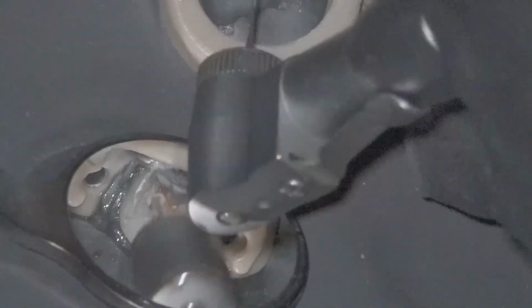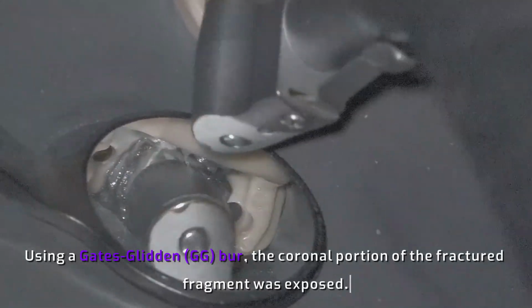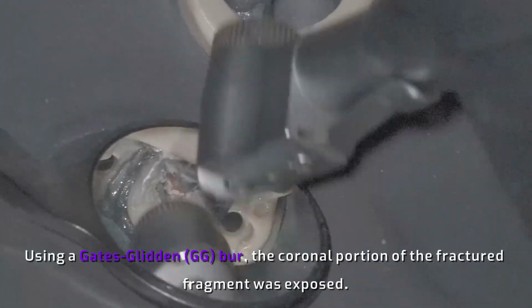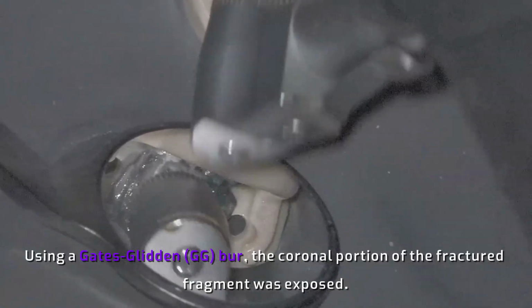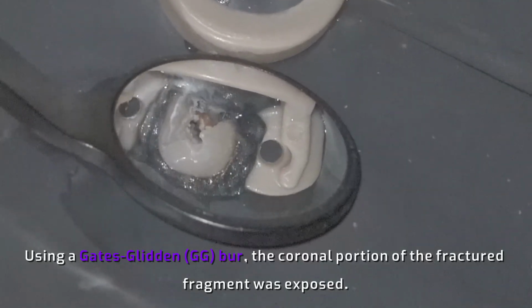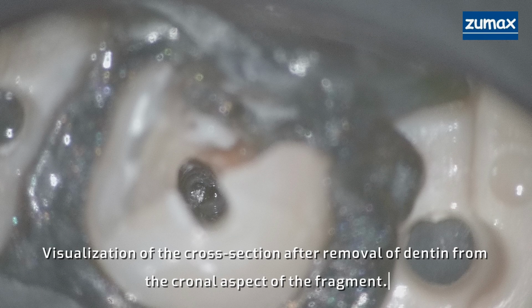the microscope. Using a Gates Glidden (GG) burr, the coronal portion of the fractured fragment was exposed. Visualization of the cross-section after removal of dentin from the coronal aspect of the fragment.